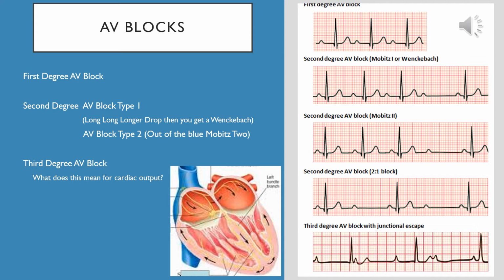Much like first degree AV block, Mobitz 1, or Wenckebach, as I like to call it, generally does not progress to a lethal arrhythmia and is usually monitored by cardiology specialty, but it is something worth noting and evaluating the patient. This pattern can be seen in a longer strip, usually easier than is shown here, because you're able to see that longer drop evaluation.